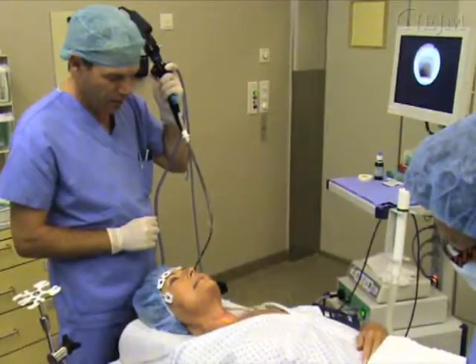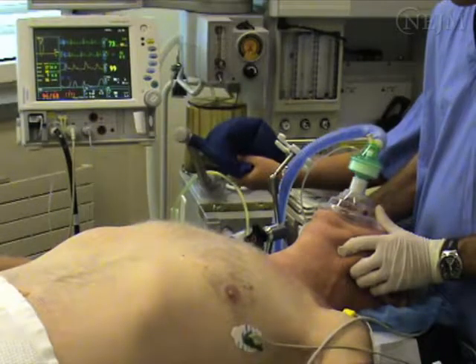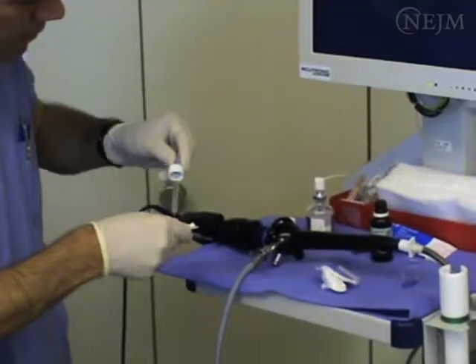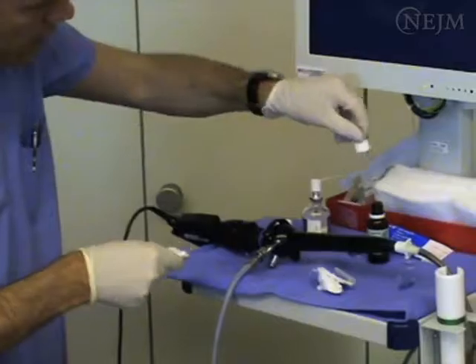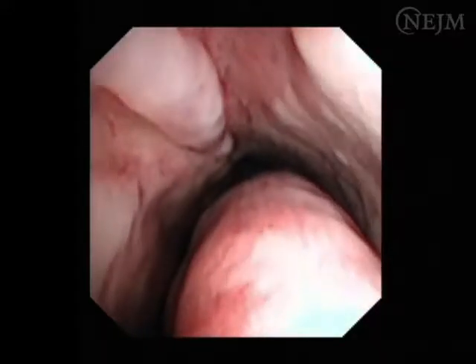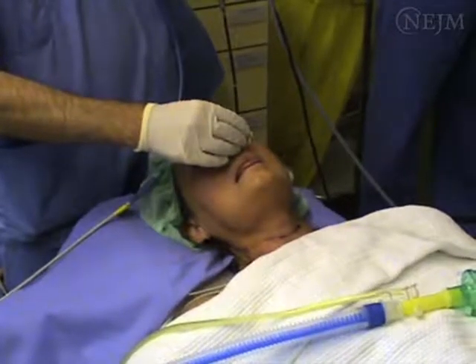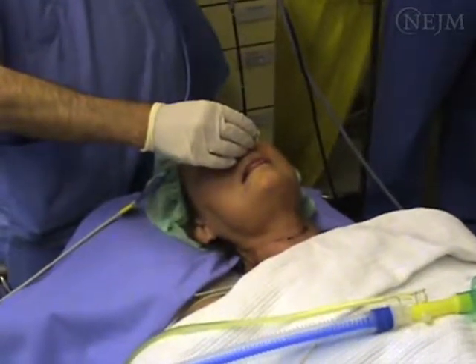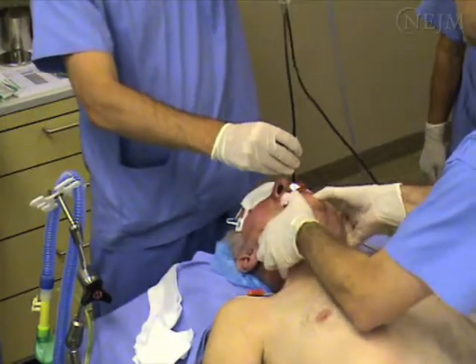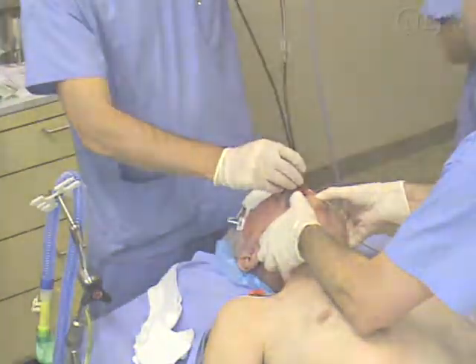There are different techniques for both situations, the nasal and oral approach in the awake and anesthetized status respectively. The choice of the equipment and medication is primarily dependent on personal preference. This video will demonstrate a nasal approach in an awake patient with a difficult airway and will also demonstrate an oral technique in an anesthetized patient whose airway presents an unanticipated difficulty.